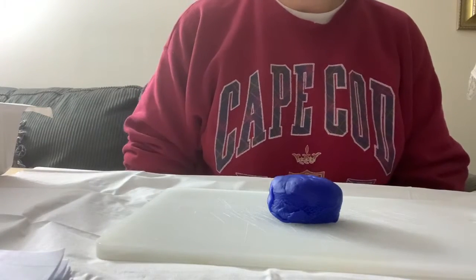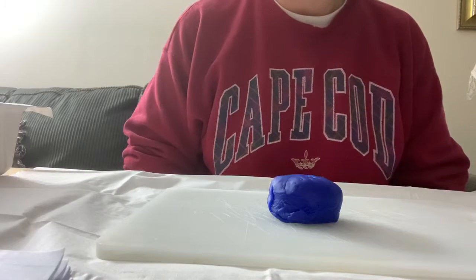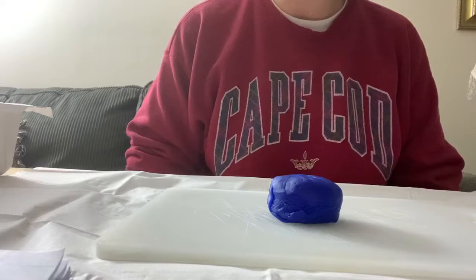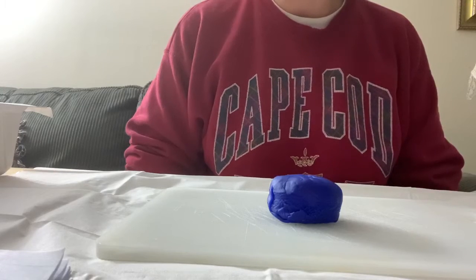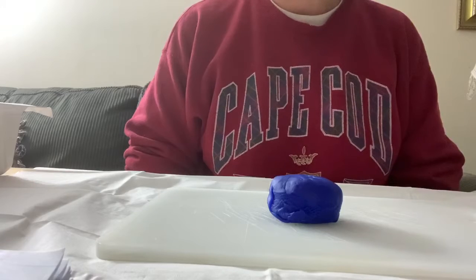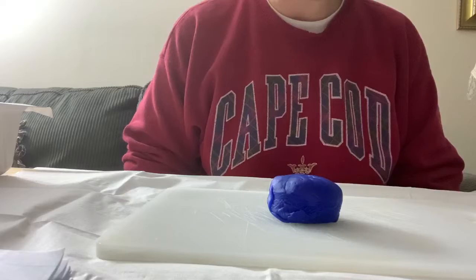In this procedure, we're going to be doing an intermittent catheterization. I've greeted my patient. I checked her identification bracelet. She gave me her name and her date of birth. This is a female patient, so she is in the lithotomy position.